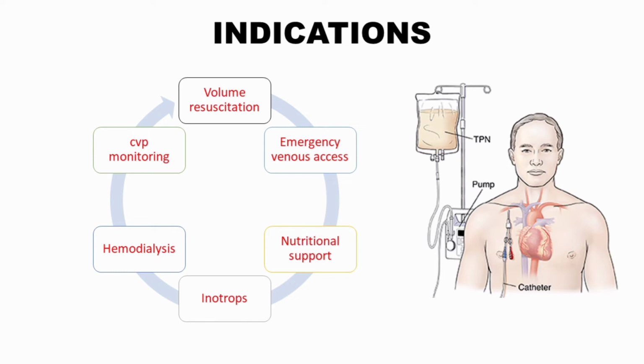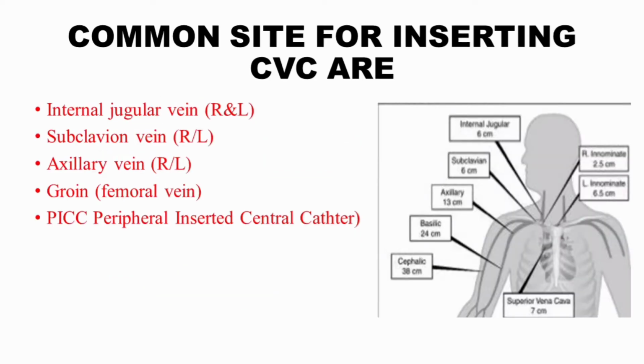Hemodialysis: to connect a person with renal failure to a hemodialysis machine that clears the body of waste and extra fluids. And another indication is central venous pressure monitoring.